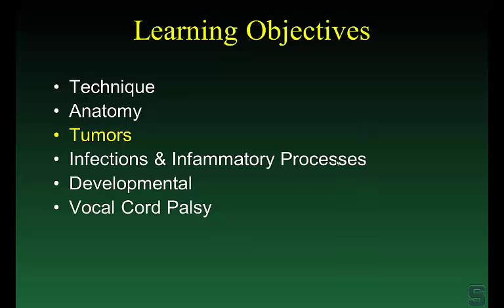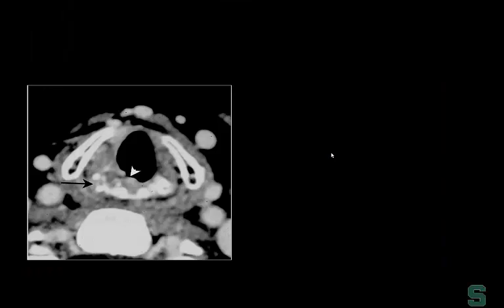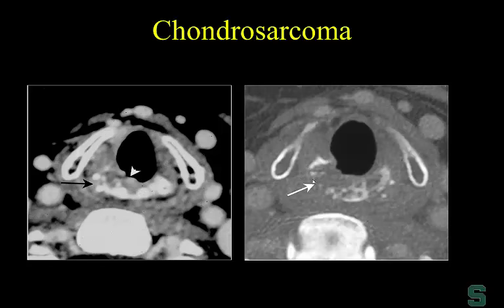Number one, by far and away, it's going to be squamous cell carcinoma. Here's a type of tumor that's primarily involving the cricoid cartilage — you can see some rings and calcifications. Endoscopically, the surgeons see a very rock-hard mass. On bone algorithm CT, we can see this lesion primarily arising from the cricoid cartilage as a submucosal, very rock-hard lesion. This is a chondrosarcoma.